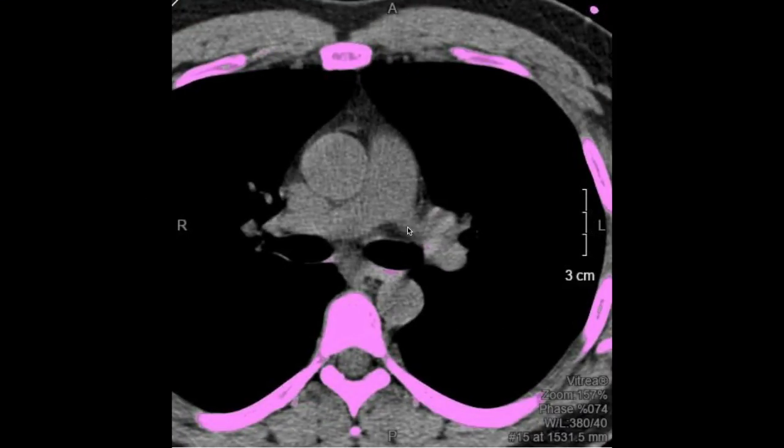Okay, so this is exactly what you're going to see when you do a CT scan of your heart. Now, this is my own personal scan, and let me orient you so that you know what's going on. This is the very top part of your heart. This is the right side, and this is the left side. Everything that you see in pink is bone, and that's exactly what you don't want to see in the heart blood vessels. This is my breastplate or my sternum, and these are my ribs that go all the way around towards the back. These are my massive pecs right here.